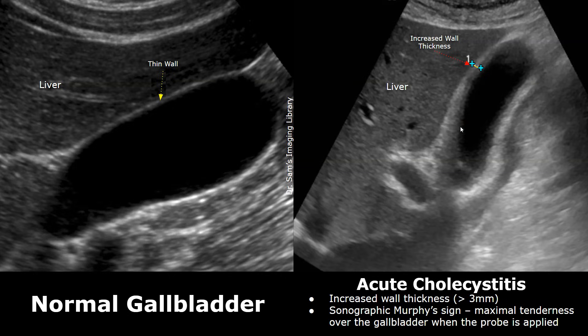Acute cholecystitis is the inflammation of the gallbladder. The normal gallbladder has this appearance. It has a thin, hyperechoic wall. It is filled with anechoic bile. The normal wall thickness of the gallbladder must be less than 3 mm.